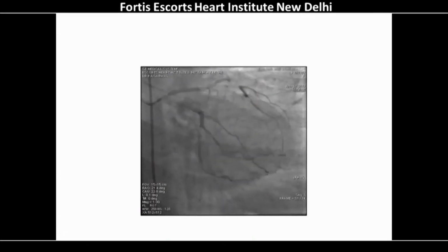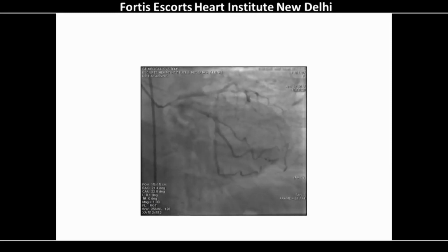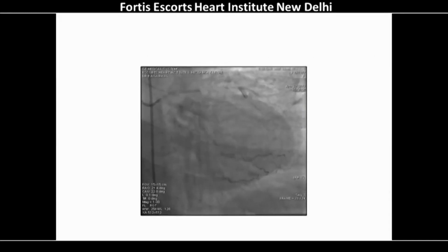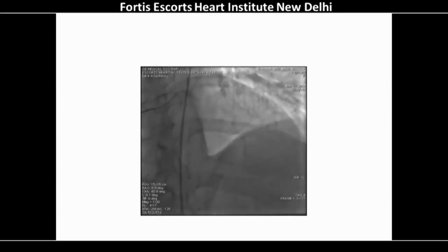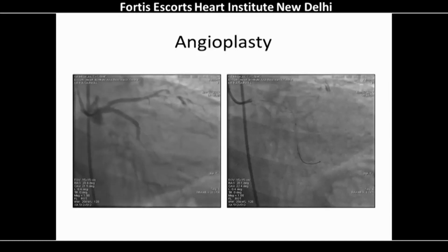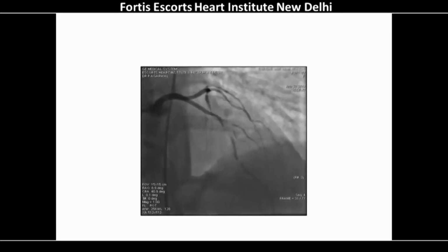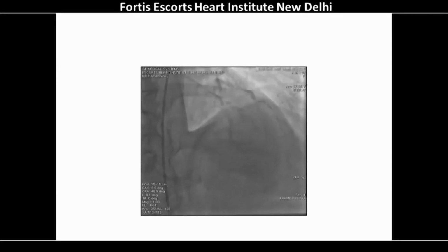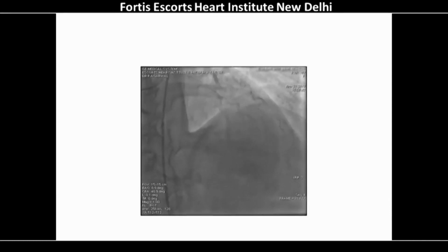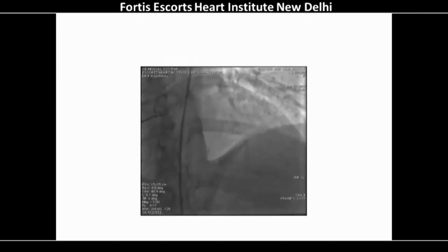This, the last OM, which was stented in 2007, shows a tight proximal stenosis. Next, please. And see the LAD. It shows diffuse disease proximal to the stent, in the stent and distal to the stent. So there is new disease involving the diagonal, and the proximal and distal LAD, and it has got distal diffuse disease. The proximal vessels are looking fine.